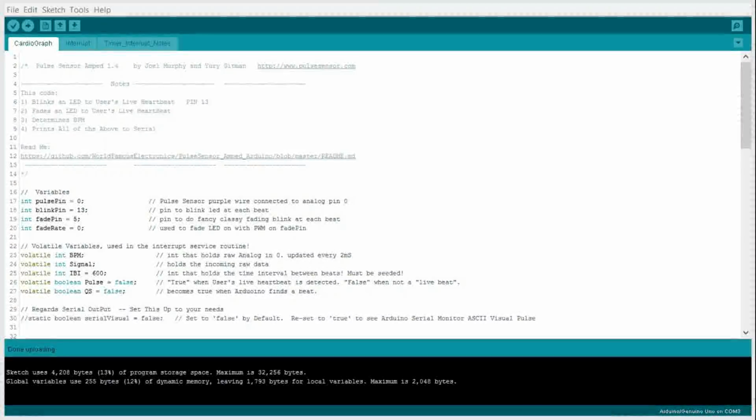Now I'm going to go over the sketch code for this application. I called it Cardiograph. And this is basically straight from Pulse Sensor Amp's website, or their GitHub site. I downloaded it and installed it, got it working, and didn't really change it that much. So basically I left everything intact, all the comments and everything.